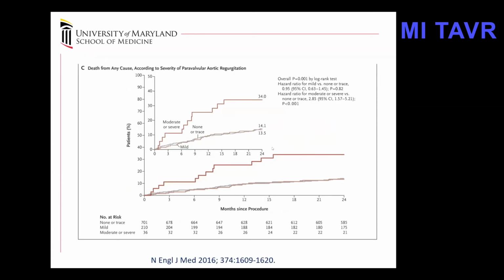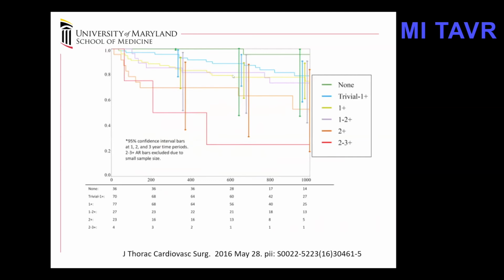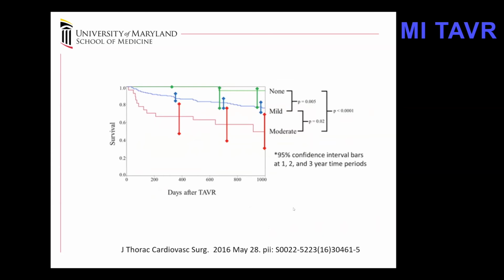You can see that if there's any significant degree of moderate or more, especially paravalvular leak, that portends a survival loss over time, and particularly in the context of TAVR. And I think this is relevant.